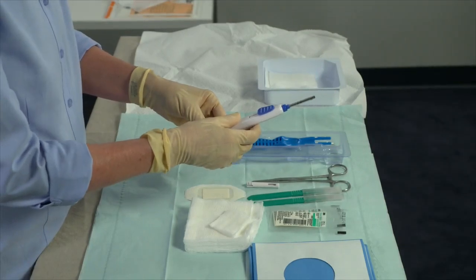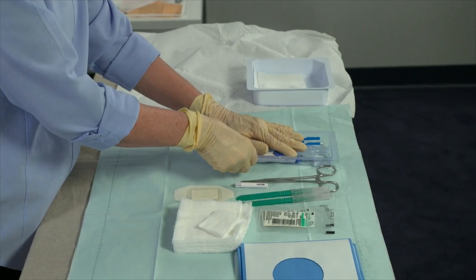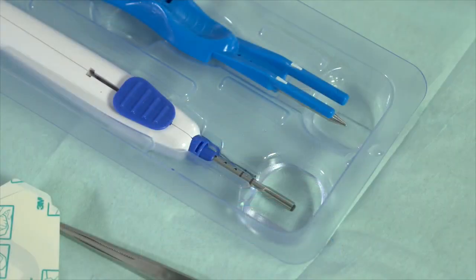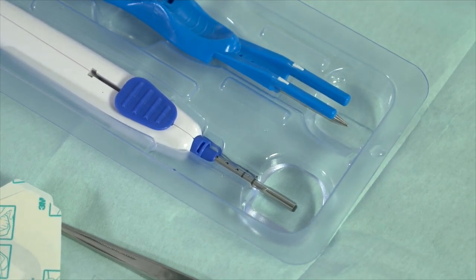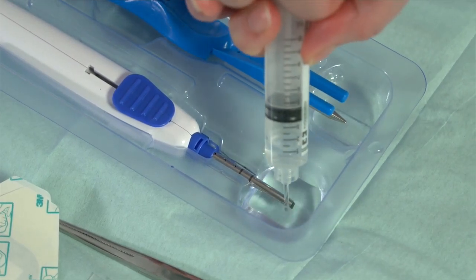Now you need to hydrate the sensor. This is done by snapping the insertion tool back into its original position in the tool tray. Ensure the cannula is submerged in saline and hydrates for approximately 5 minutes. Your assistant can add more saline if needed.